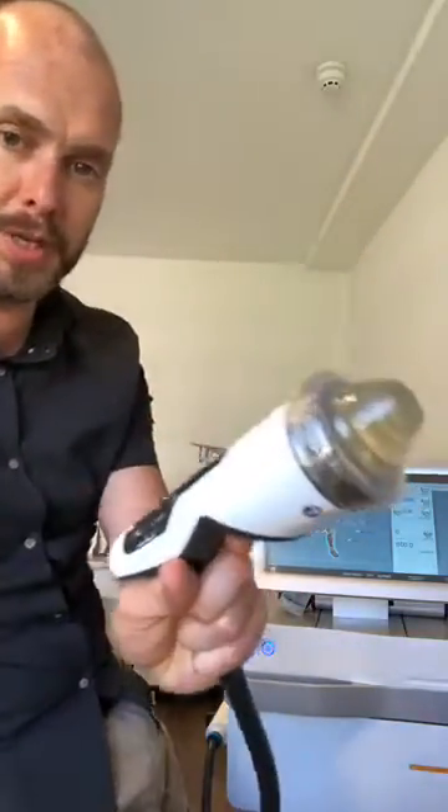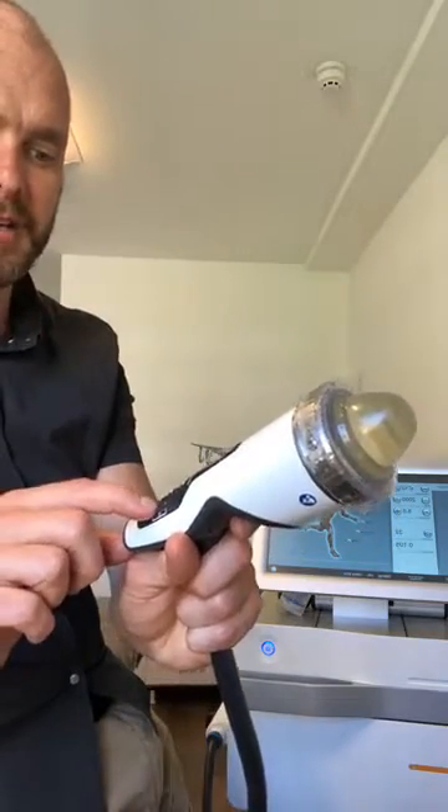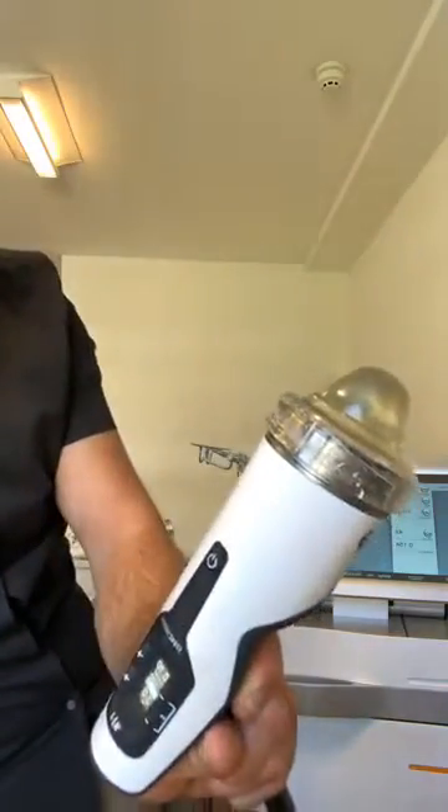It's a much slower clicking sound audibly — we're on six hertz there, and you can come right down to about three hertz. So the treatment takes a lot longer.